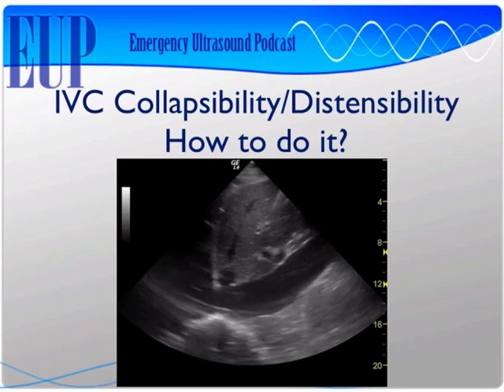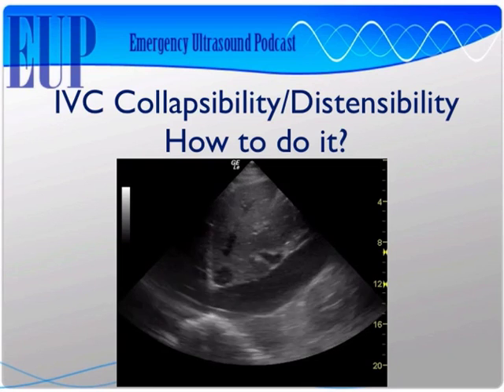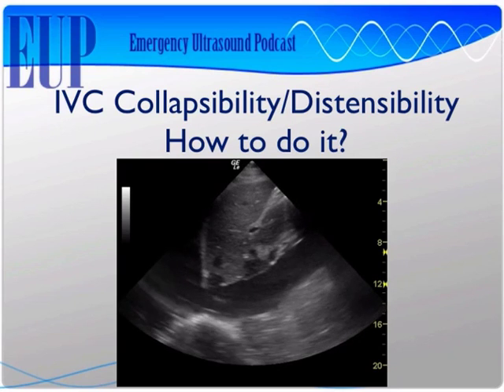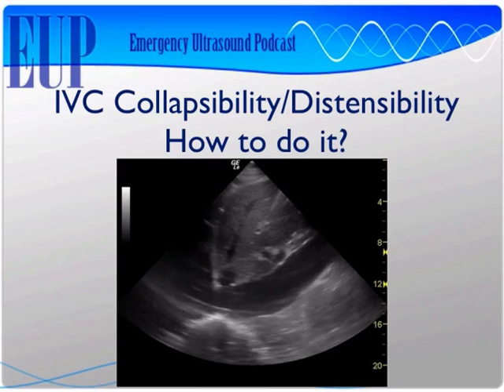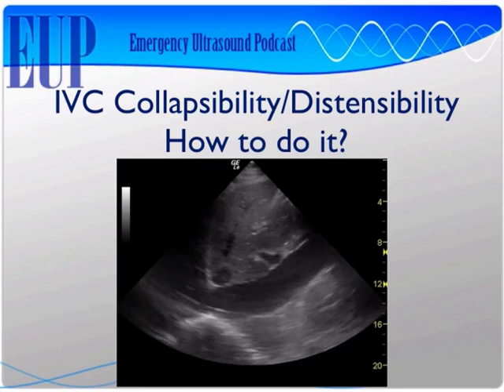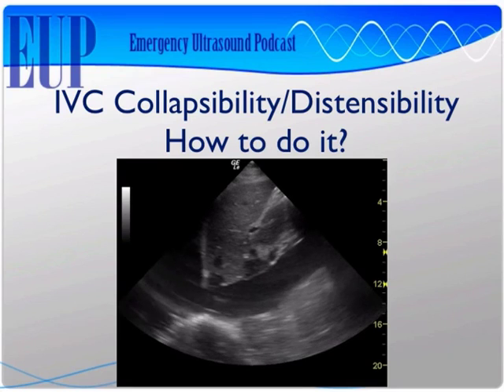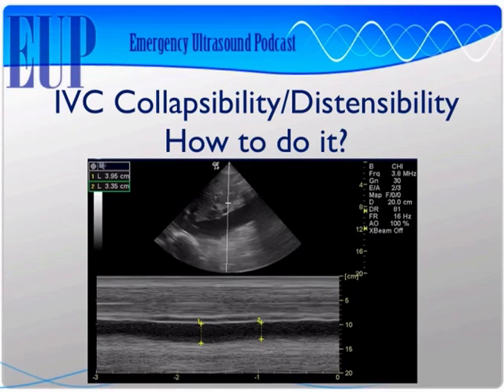This patient could have a PE, they could have right ventricular failure, they could have pulmonary hypertension. There's lots of reasons why the IVC could be big, and that's what sort of concerns me about using this as a determinant for fluid responsiveness. But I think in the patients who have fairly decent cardiac function, we're probably okay doing this. So here you can put M mode right there on the IVC and look at the respiratory variation. Here we see the diameter change from 3.95 centimeters to 3.35 centimeters, so hardly any change at all. Definitely would not be greater than 18%. This person would not fall in that criteria for needing fluid.